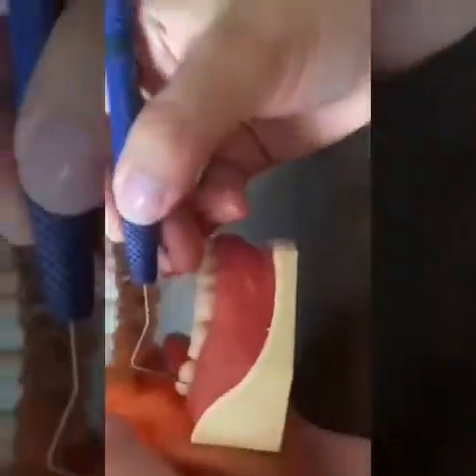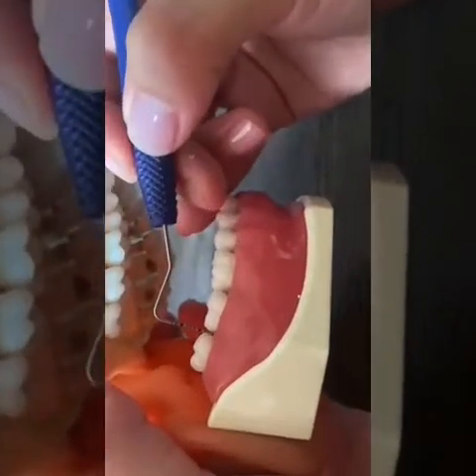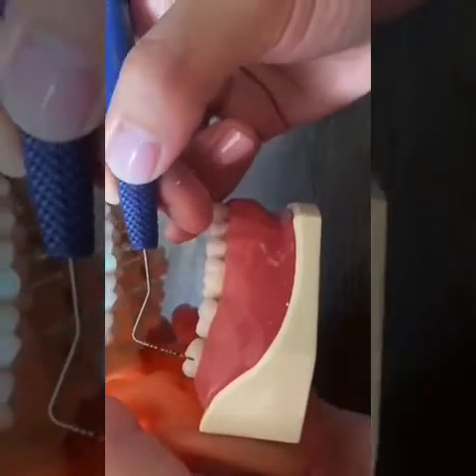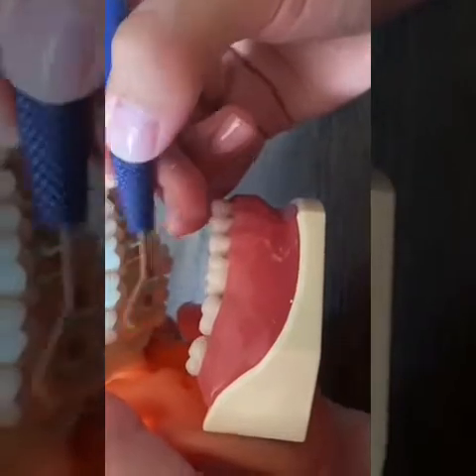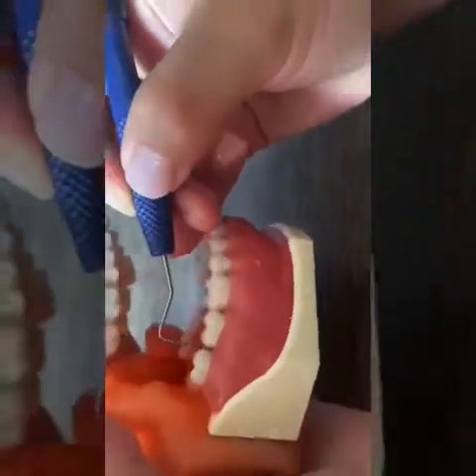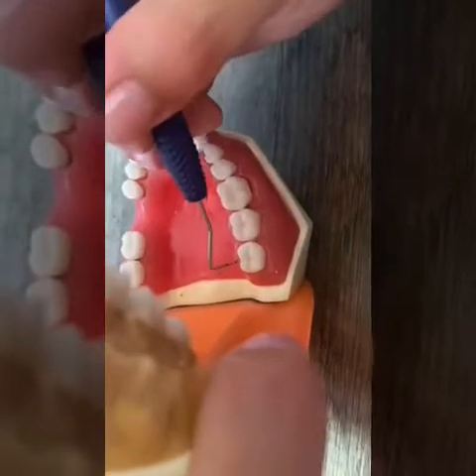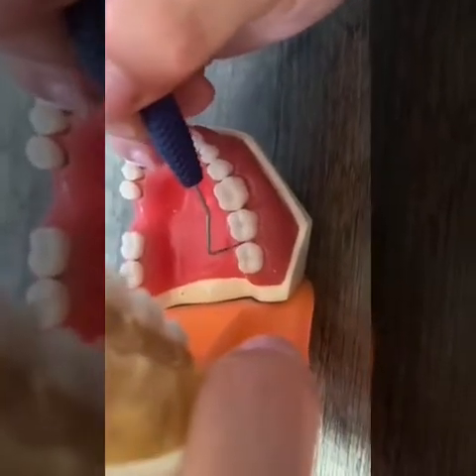The distal facial, which is right here. Then it's the facial, and the mesial, which is right here. So it's the distal, the facial, and the mesial. So that's 3 measurements. And then you go on the inside, which is the distal lingual, which is right here. Then it's the lingual, and then the mesial lingual, which is right here.